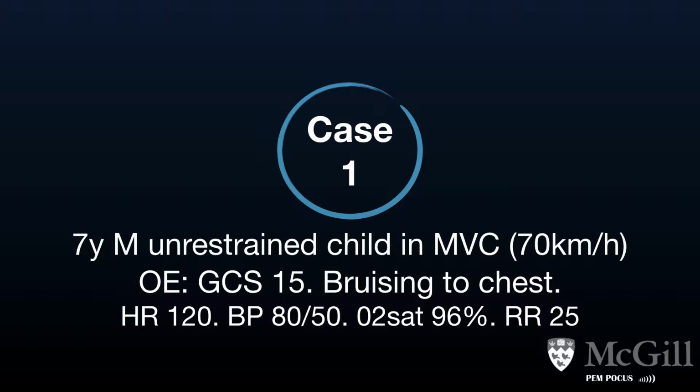You identify that this child is tachycardic and hypotensive. You suspect hypovolemic shock secondary to bleeding in the context of trauma. As you initiate resuscitation, you decide to perform point-of-care ultrasound to confirm your clinical suspicion.